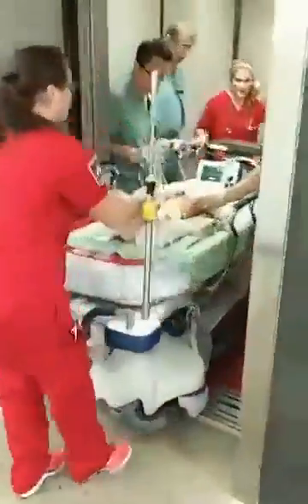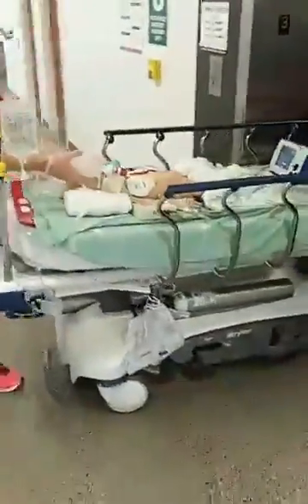Can we shock it? No, no shock, everybody. It's still normal sinus. And we got a pulse. Yeah, we got a pulse. So we're tachy because we're probably low on fluid.